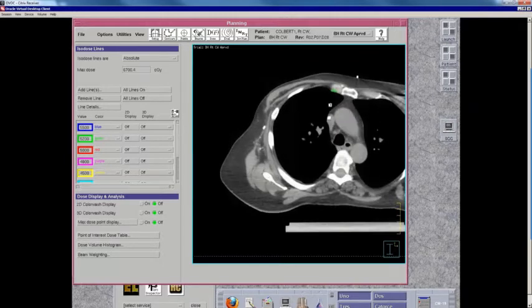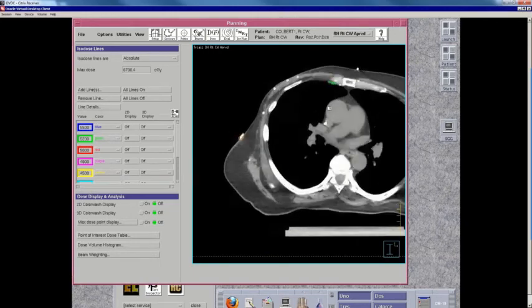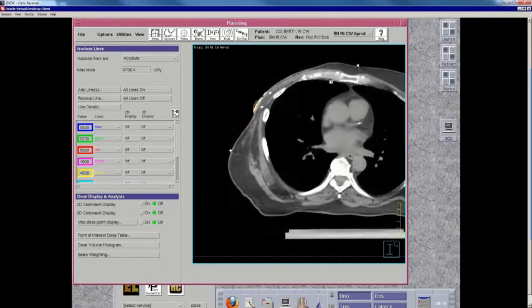And then I go down to the top of the fourth rib. I'm not sure what that's doing. I don't know, it looks like there's some clip that got there somehow. I contoured that as well. So we come down to the bottom of the fourth rib, which is going to be about right there.